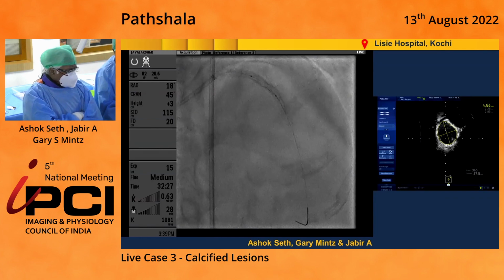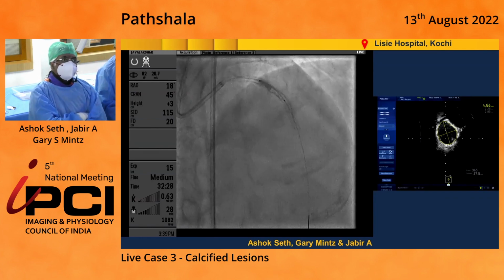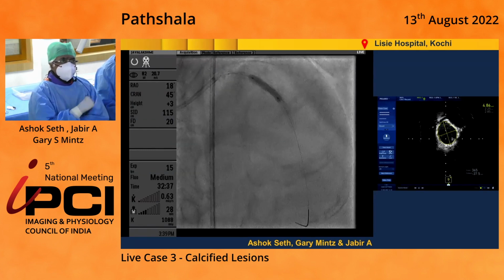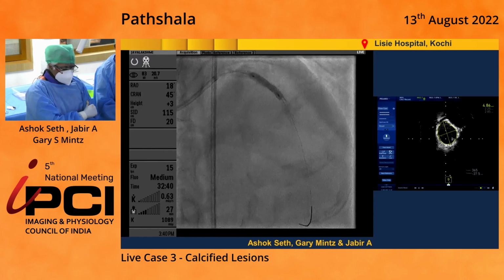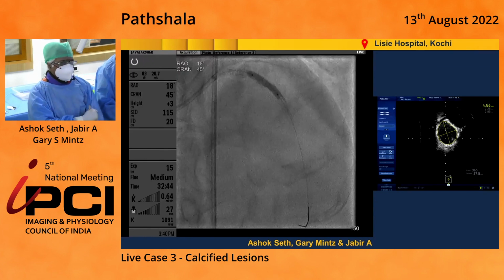While you're at it, it's 10, 15, 20, 25, 30. Yeah, just sit at 30. And we're going to go up gradually now. 32, 34, 35. Holding at 35.